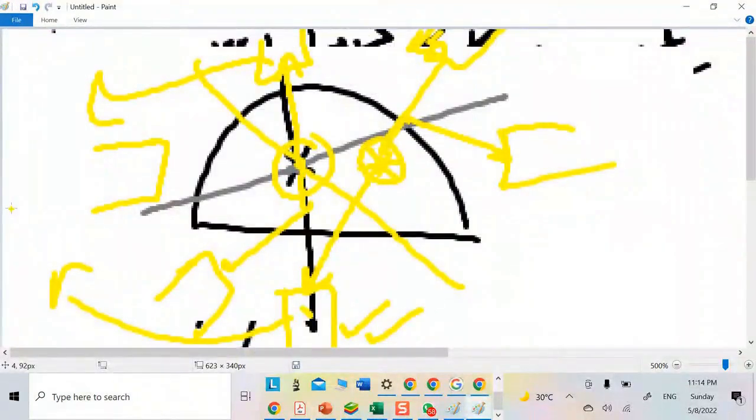How can the detector handle them? We all say it depends on the energy. I mean, the detector will handle it, but it depends on the energy. Now something new has come up called timing resolution. This new development in timing resolution is a significant advancement in the field.